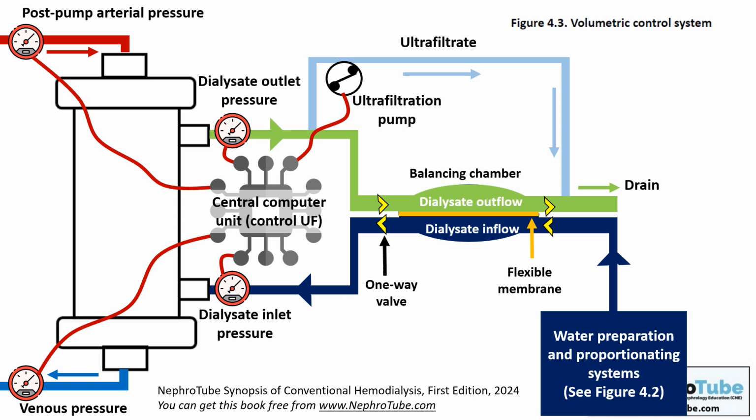Before going to the next point, I want to mention important information that I didn't mention in this chapter, but I will mention in detail in chapter 6, inshallah, about the dialysate flow rate. The dialysate flow rate ranges from 500 to 800 ml per minute.